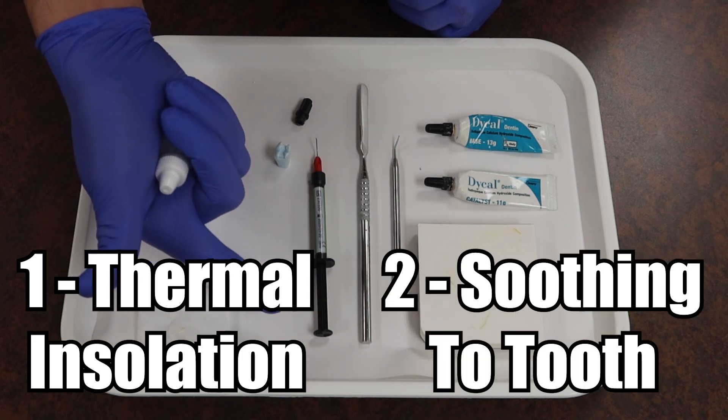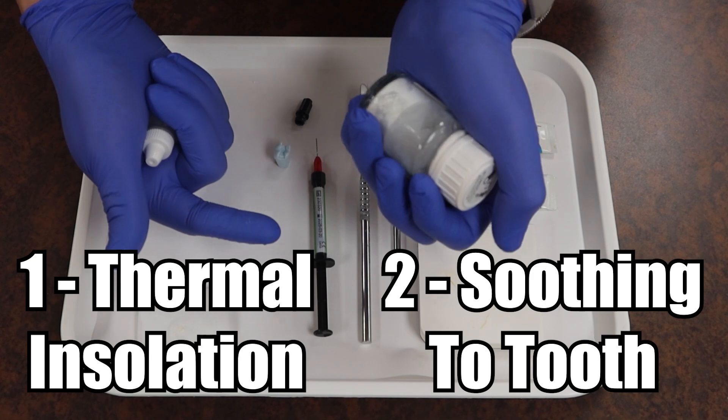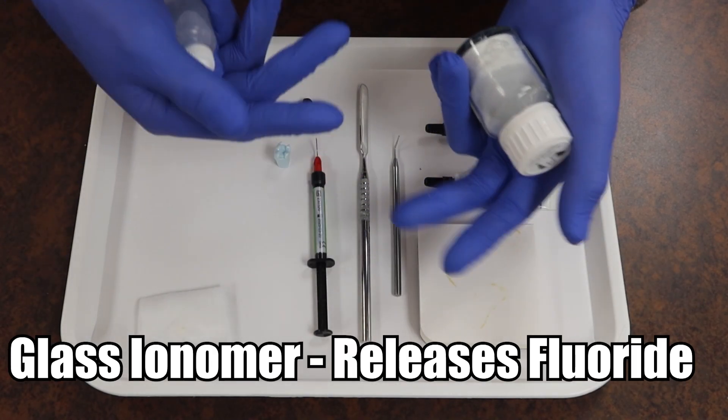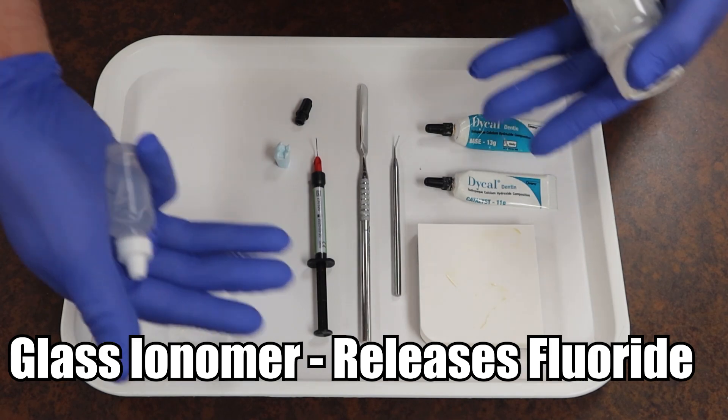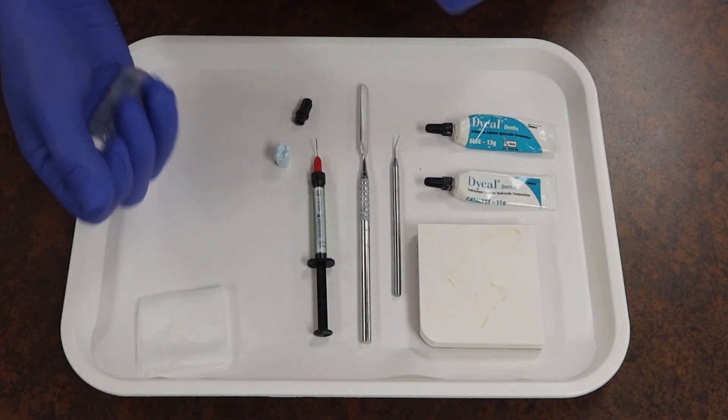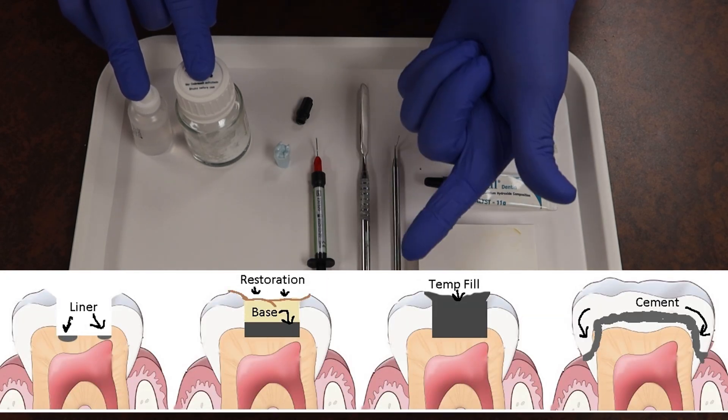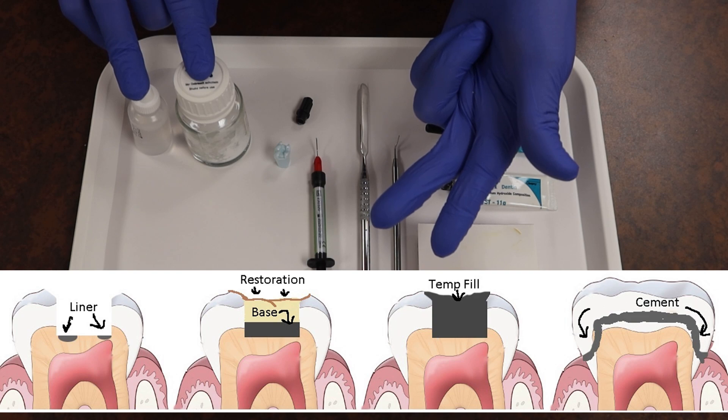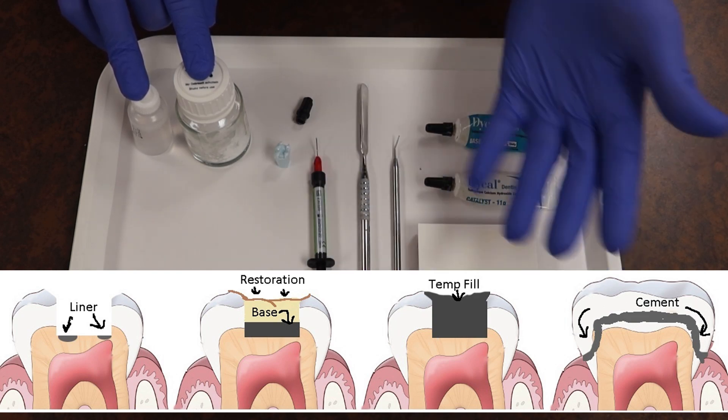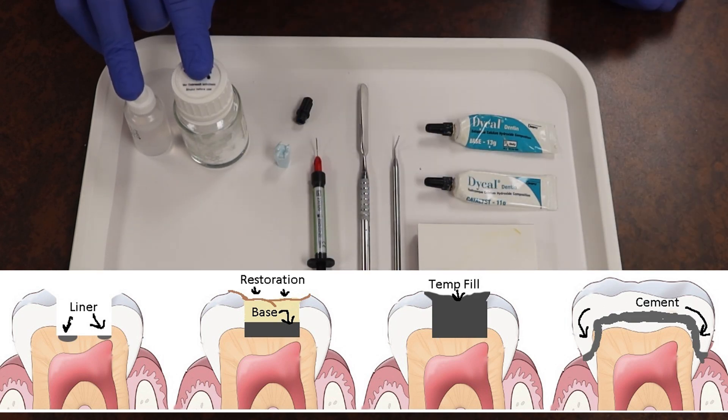For sensitivity properties, since glass ionomer has a beautiful thing of having fluoride releasing capabilities, the fluoride helps to soothe the tooth after this deep cavity is done. Another nice thing about glass ionomer, in general, is depending on which one that you get, you can use it as a liner, a base, a temporary filling material, a cement, and the list goes on and on with the capabilities that this is able to do.